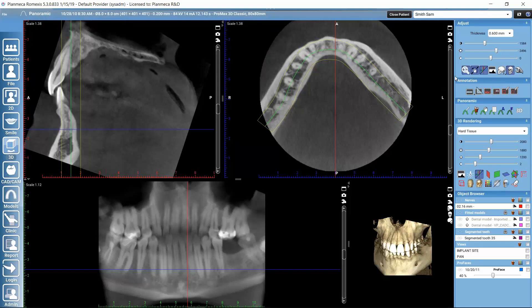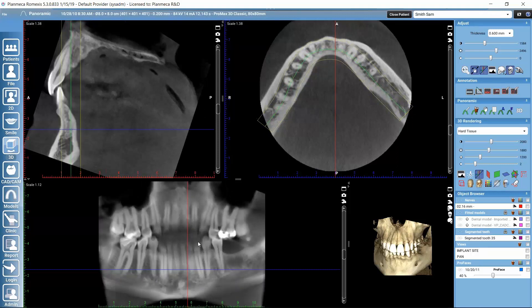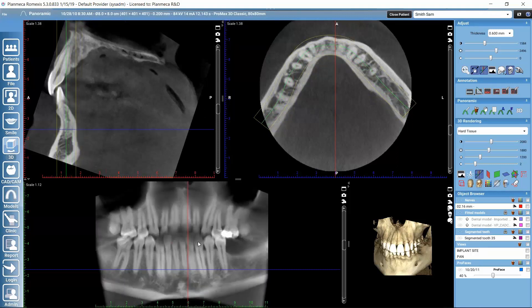There is also the function export to other views, which can be used to transfer coronal adjustments to this panoramic sub-module. We can also change the focal plane from where the view is taken. If we deactivate the toggle zoom and use the mouse wheel, we can browse here in the panoramic stack, and the focal plane gets moved accordingly, allowing us to change the radius of the panoramic curve.